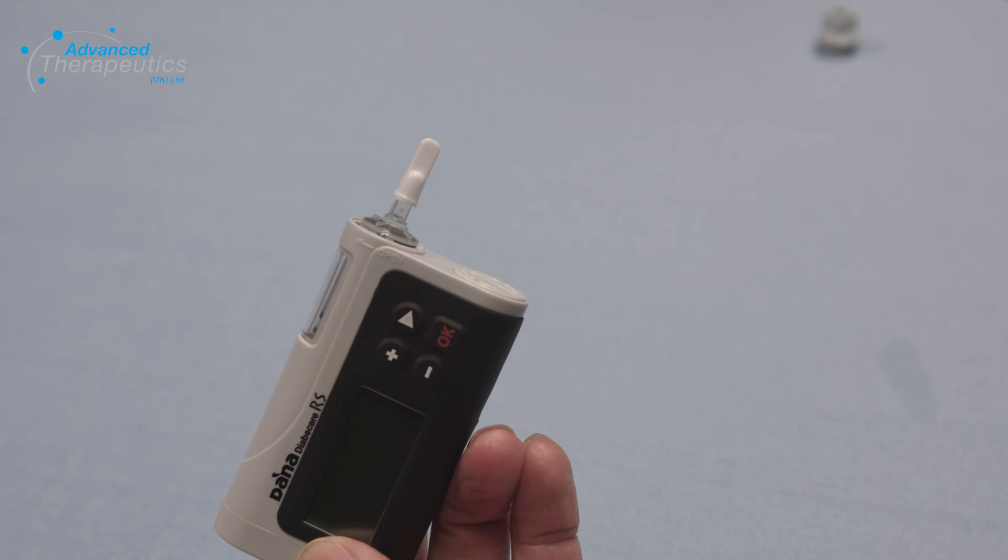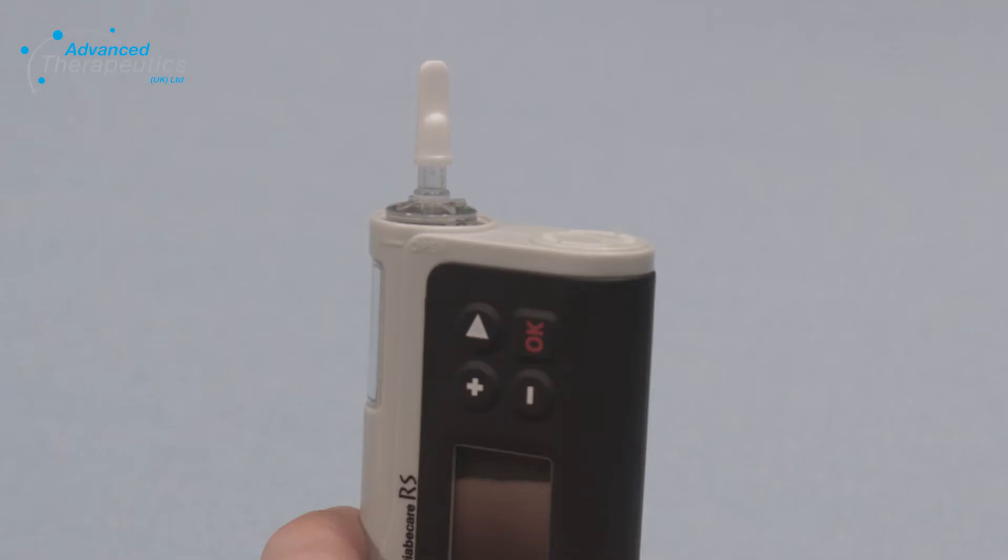Gently drop the reservoir into the pump, never force it in. If fitted correctly, the main body of the reservoir should protrude around one millimetre out of the pump.